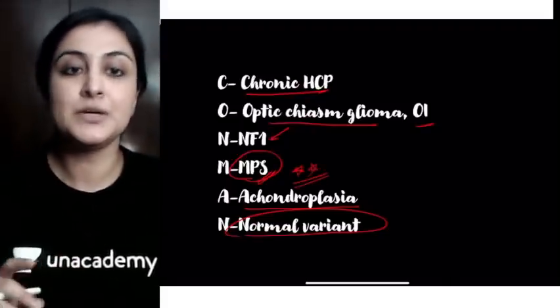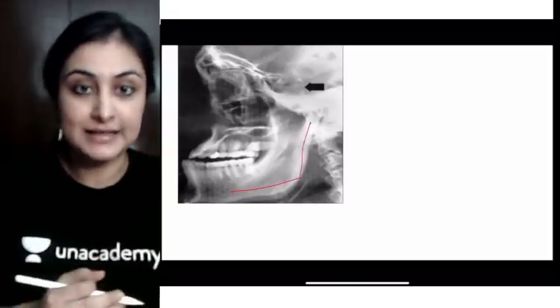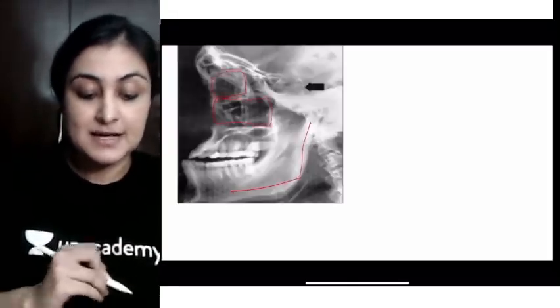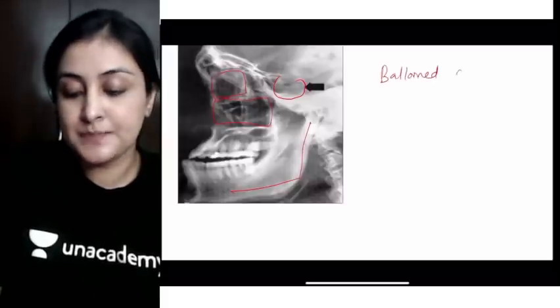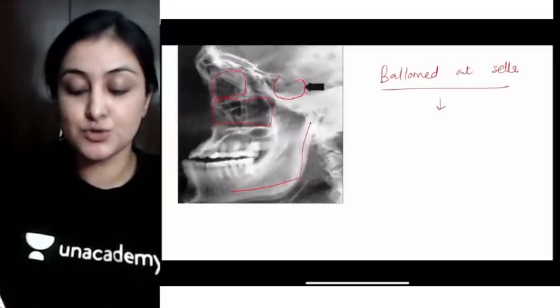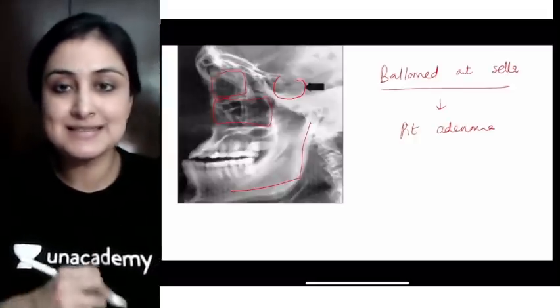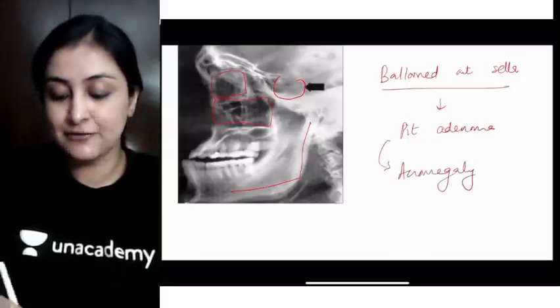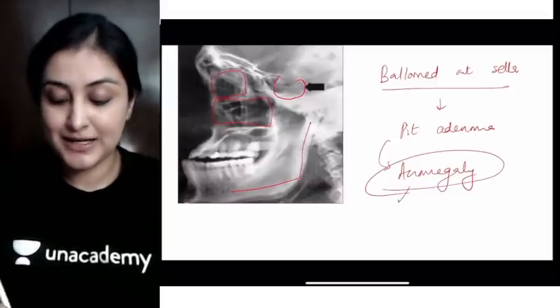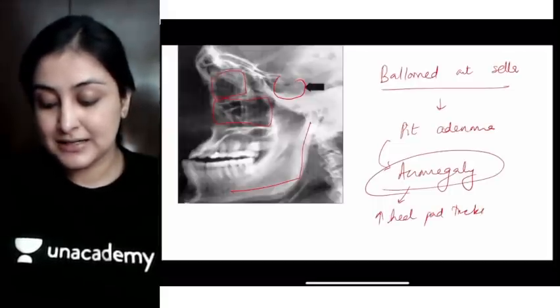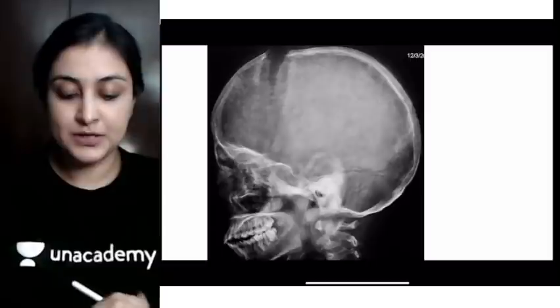In this case, we see prognathism of the mandible, increased size of the sinuses, a thickened calvarium, and an enlarged — ballooned out — sella. This ballooned-out sella appearance is associated with a pituitary adenoma. The prognathism, enlarged sinuses, and increased connective tissue are associated with acromegaly, suggesting a GH-producing adenoma. One specific feature to look out for in acromegaly is increased heel pad thickness — if you see an image of the foot with increased heel pad thickness, always think of acromegaly.